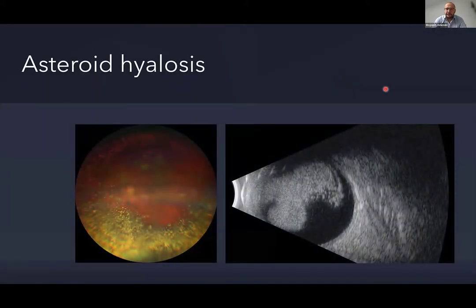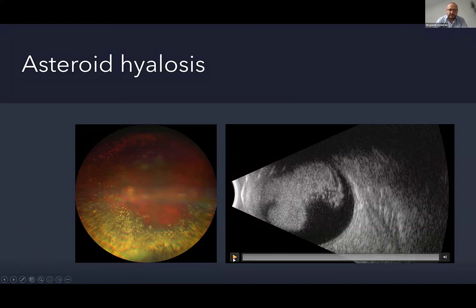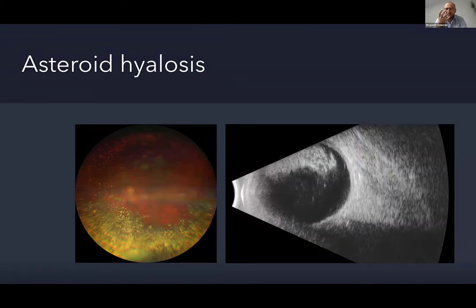Some other uses for ultrasound in patients with floaters or floaters-related problems is asteroid hyalosis. That's always a very impressive image, right?